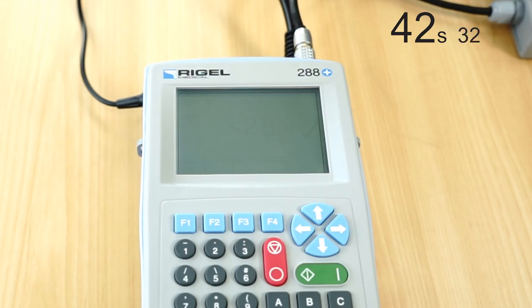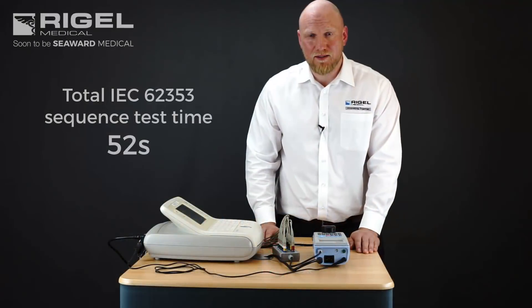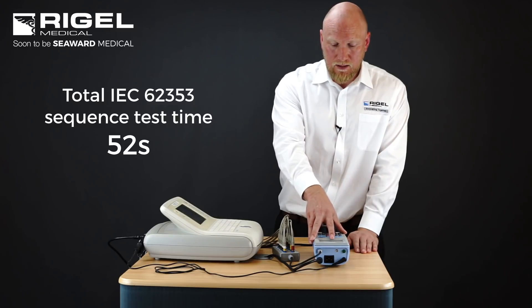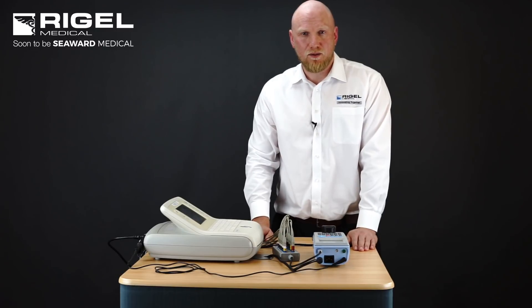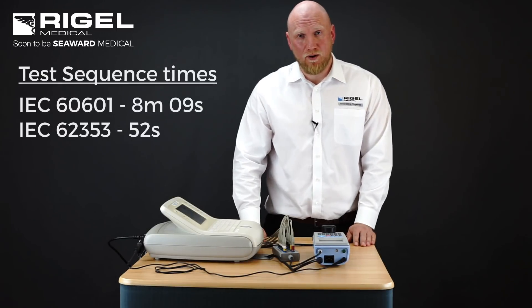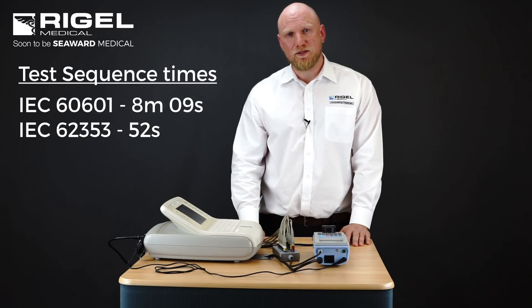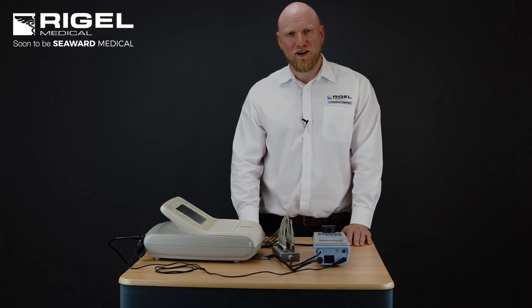It will do reverse mains, then once the end of the sequence is complete and we're satisfied with our readings and pass/fails, we can again enter user comments and save those results to the 288's memory. The comparison clearly shows that there is a massive time-saving opportunity when testing to IEC 62353 versus IEC 60601.